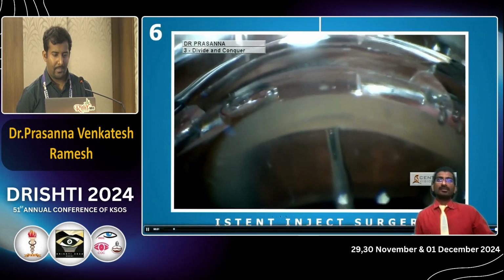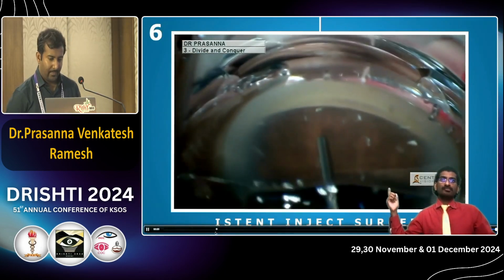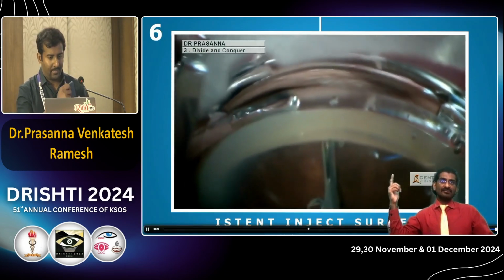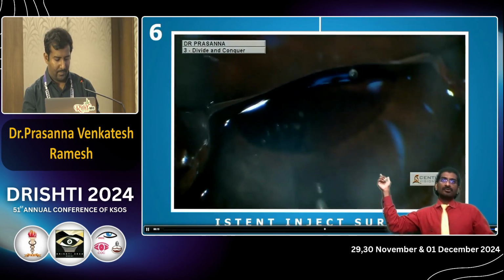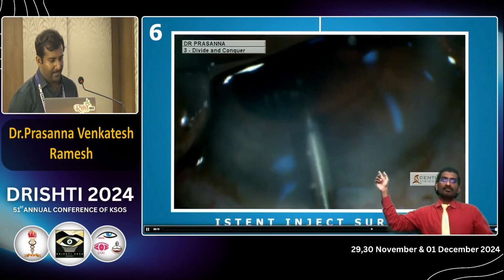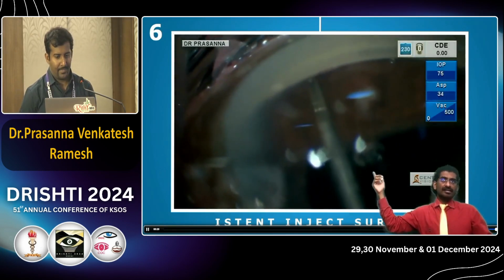And again, one of my surgical simulators, when I did one of my mixed cases, I did have a stent drop, but all's well that ends well. I placed the second stent first, and then you see the challenge is if you don't close your trocar, again I lose it in my phaco wound. So these kinds of drop stent cases gave me an idea. Of course, I placed the stent rightly at the end in this case.